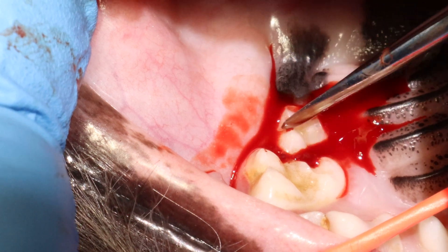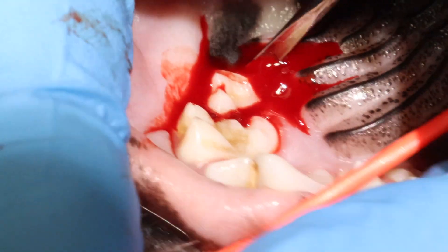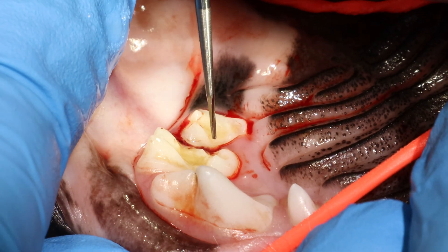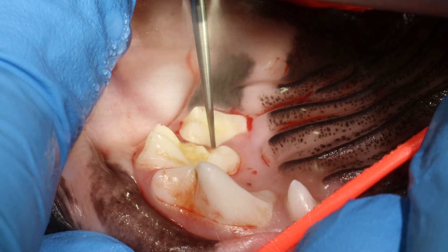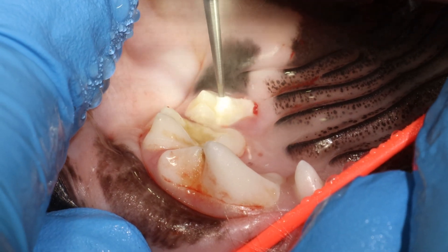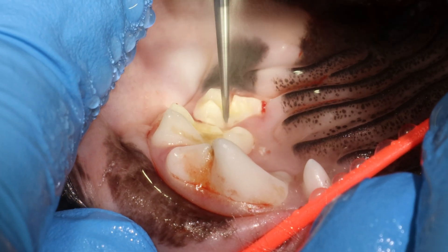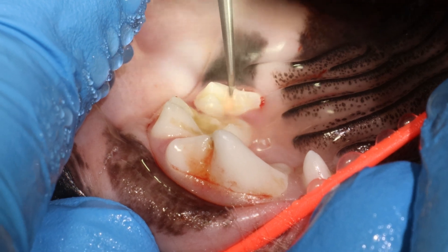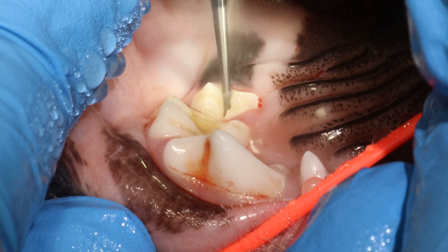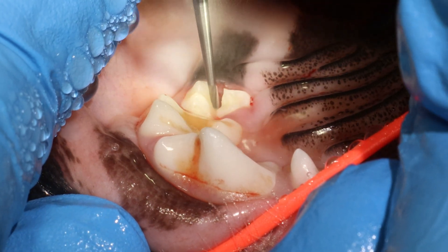When you see it bleeding, that's a nice sign that you have torn or severed the periodontal ligaments — those are the ones that are bleeding. Here I'm putting on a long root tip burr, and I'm sectioning this tooth into the three roots. First I'm always going straight across here to release the palatal root, and then after I will section the two buccal roots.